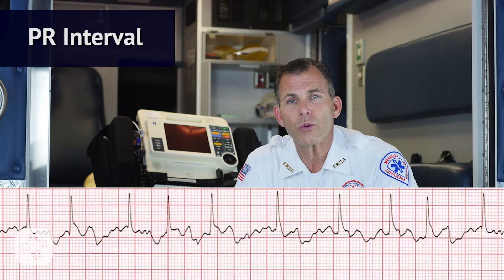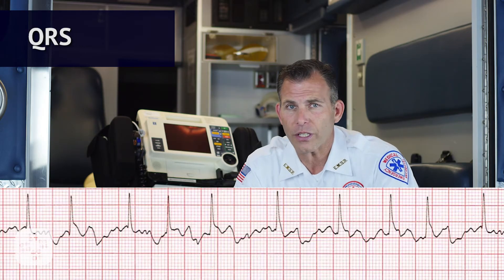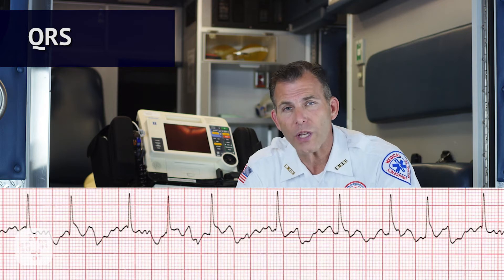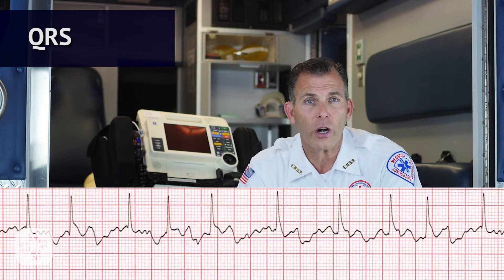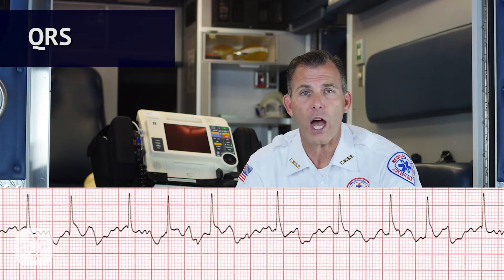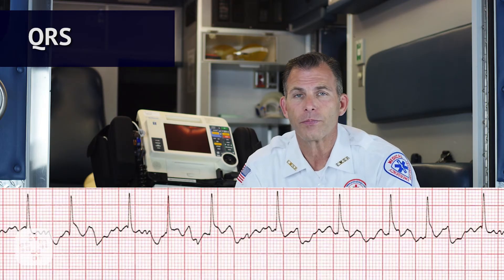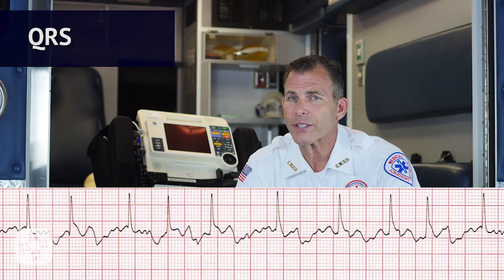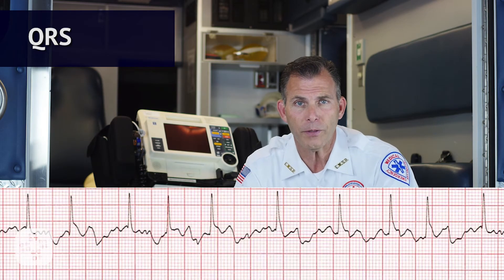Next we move on to the QRS complex of the ECG. Is the QRS interval less than 0.12 seconds? Yes — the QRS is within normal range. Is the QRS wide or narrow? In this case, the QRS is narrow. Are the QRS complexes similar in appearance? Here we can see that each one does look similar.